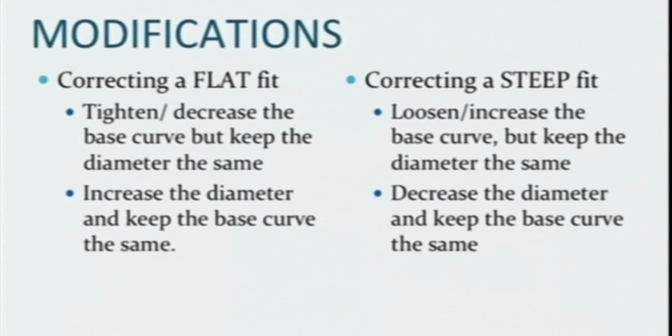How do you modify this? If it is going to be a flat fit, tighten and decrease the base curve, but keep the diameter the same. So it will be inversely proportional. And if you are going to increase the diameter, keep the base curve the same.